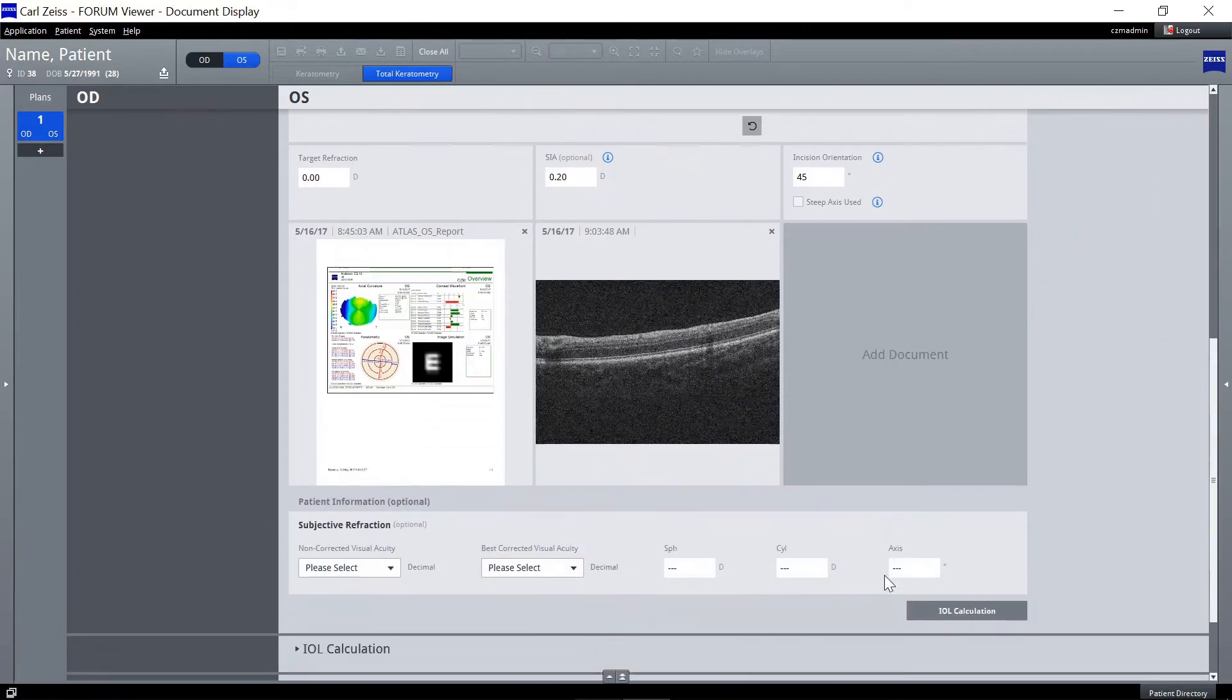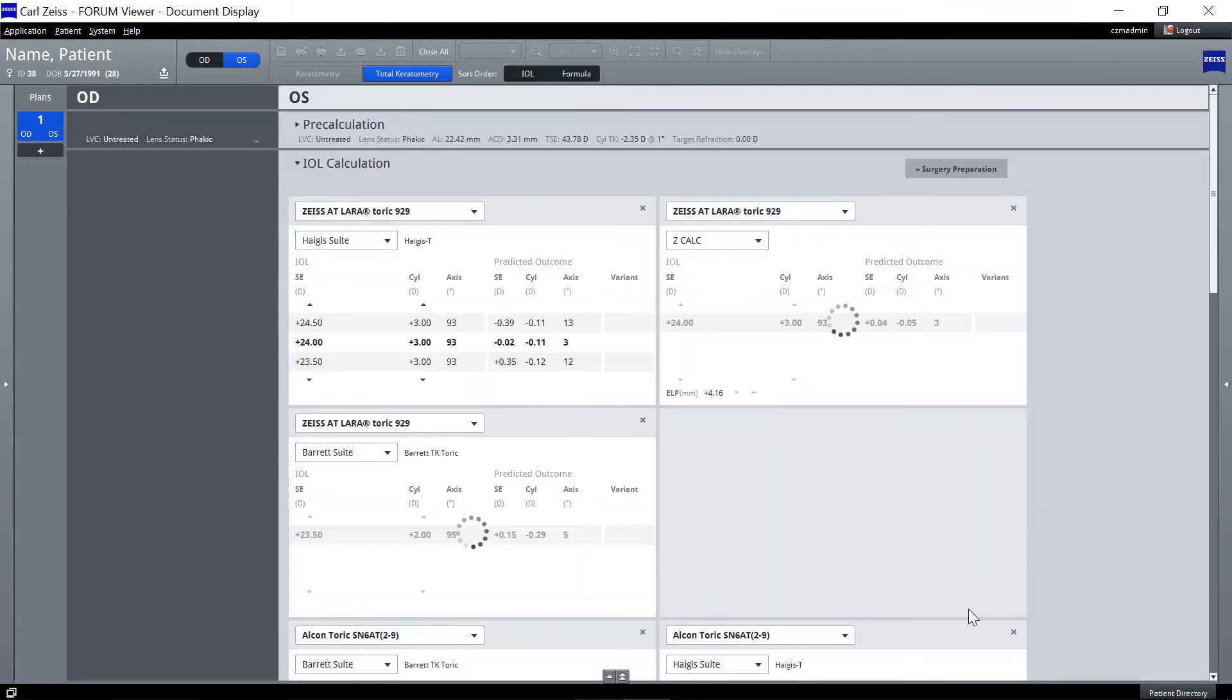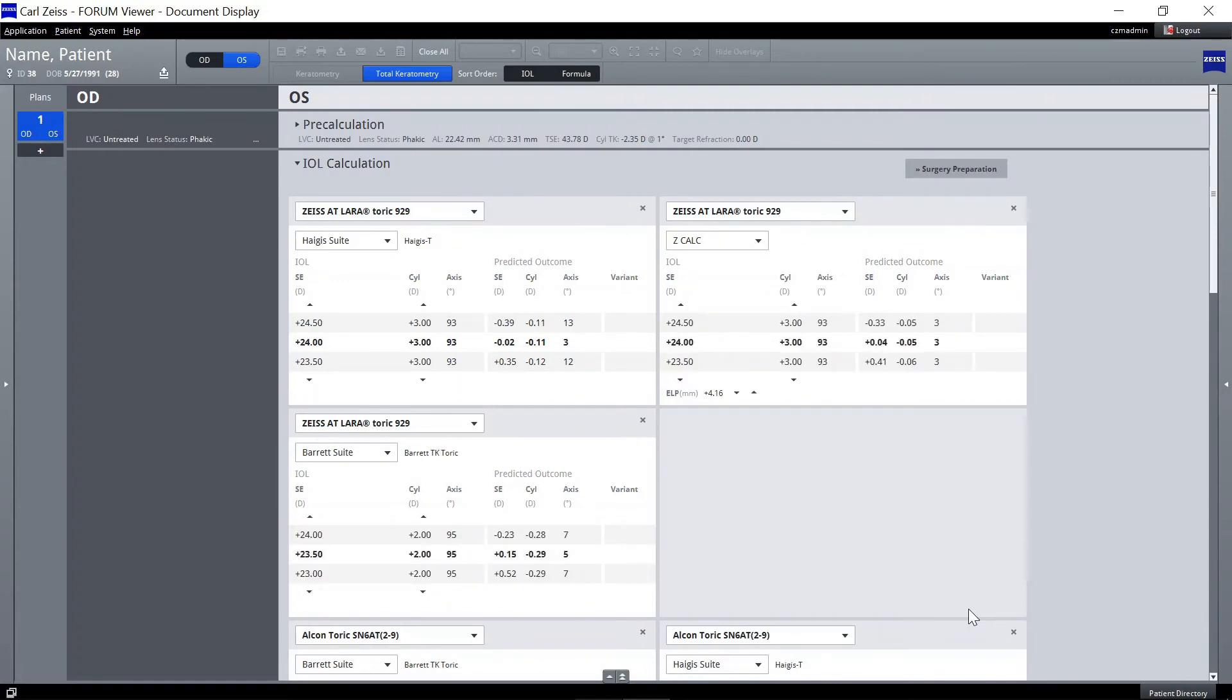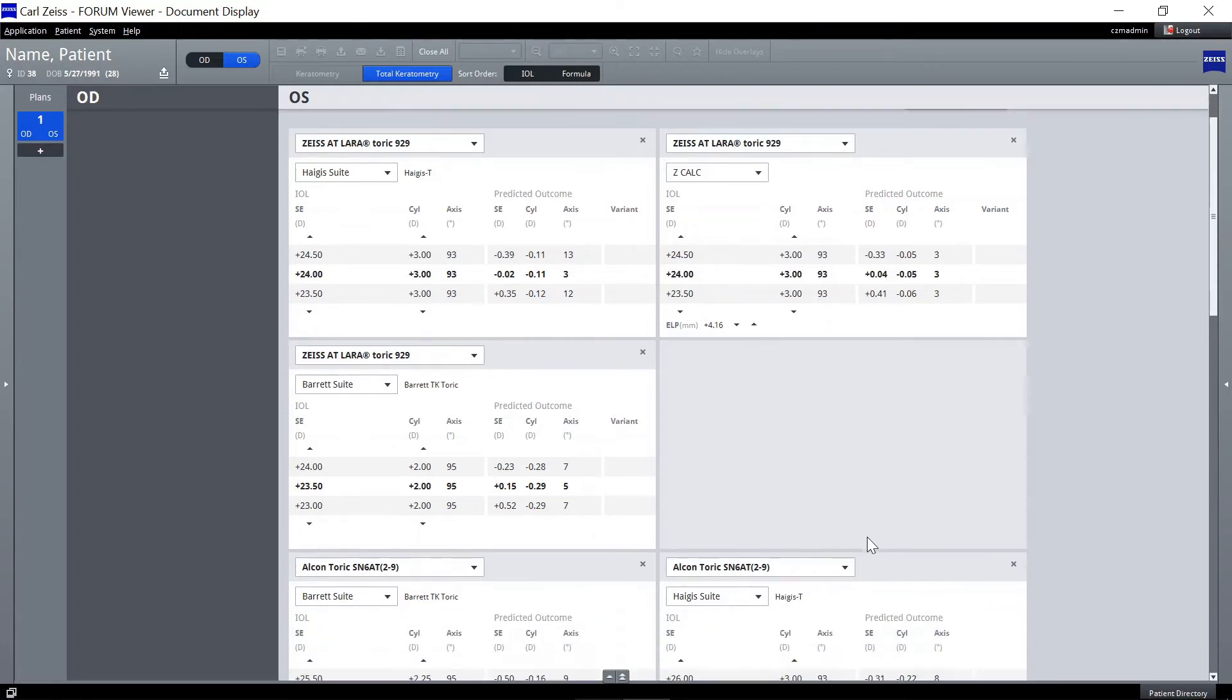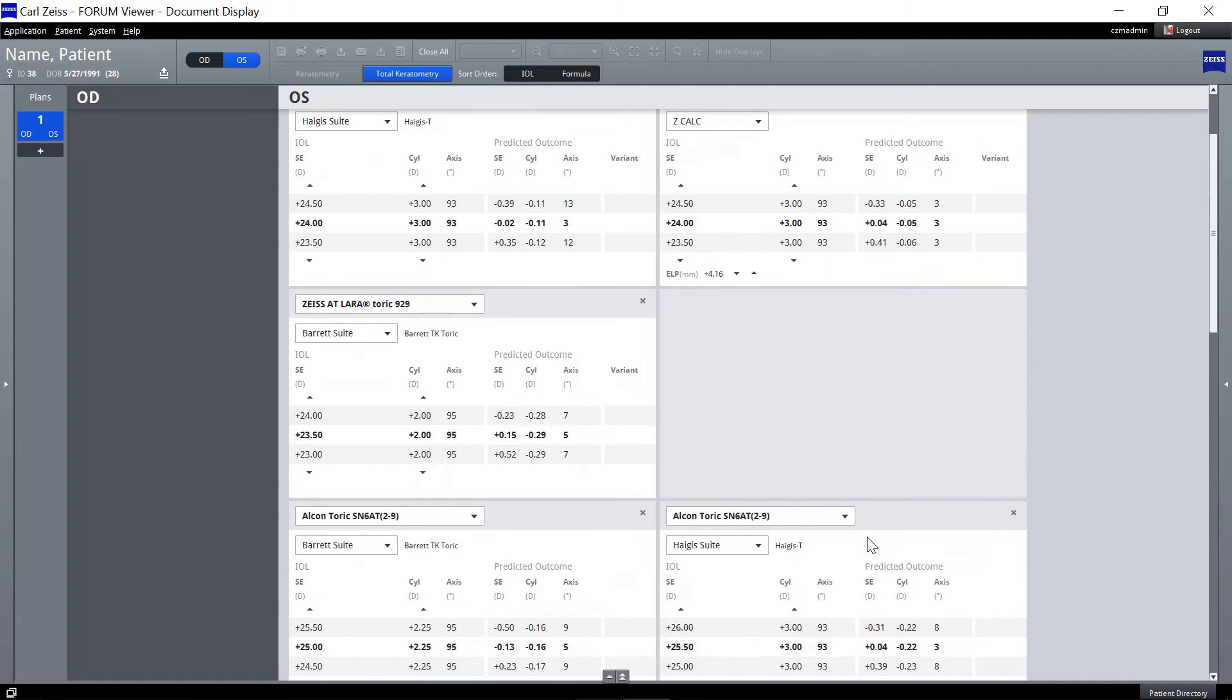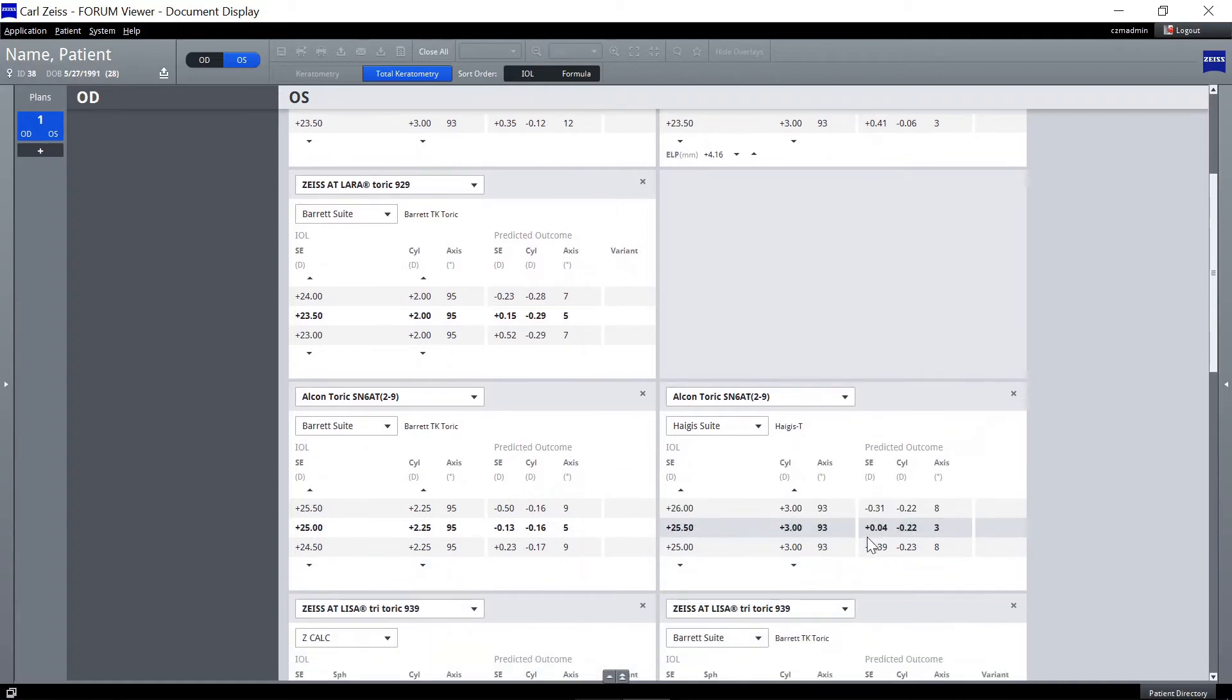Click on IOL Calculation to move to the next step. Review the predefined IOL calculations and choose the final IOL from the calculations, or add another IOL for calculation if the suitable lens is not yet calculated.